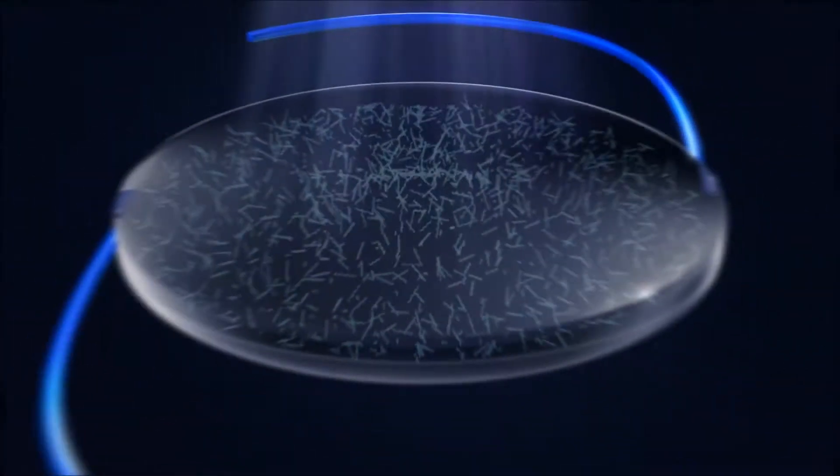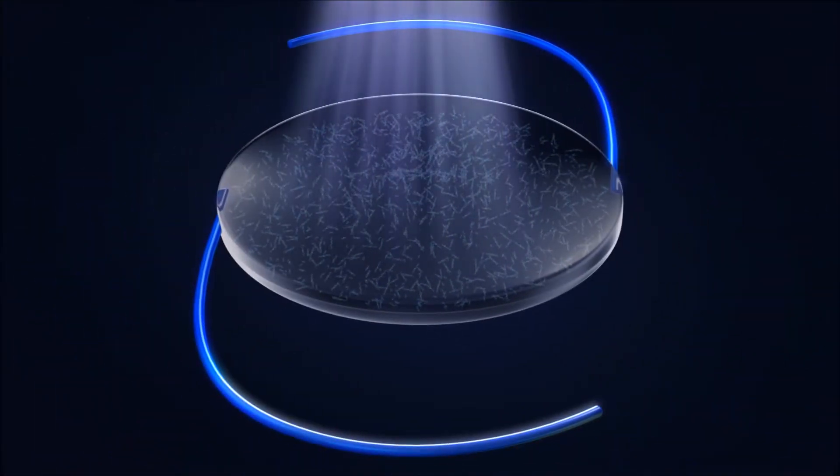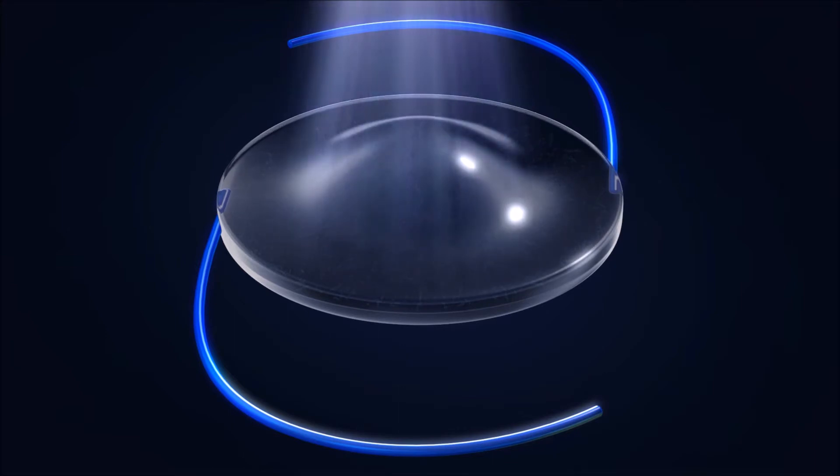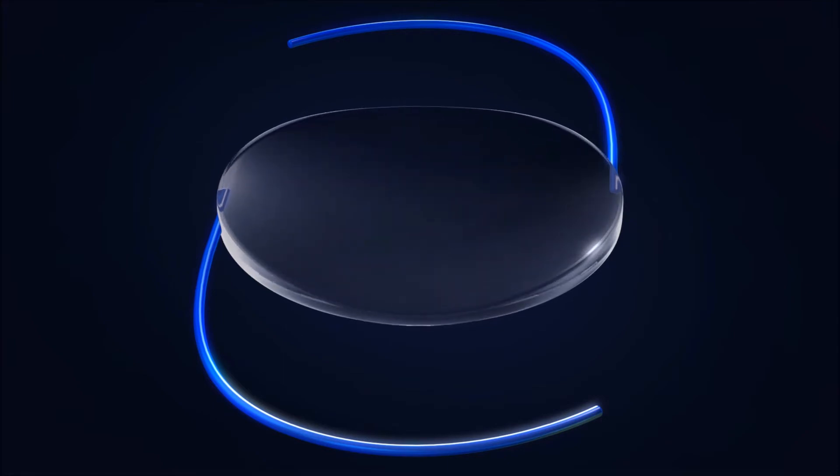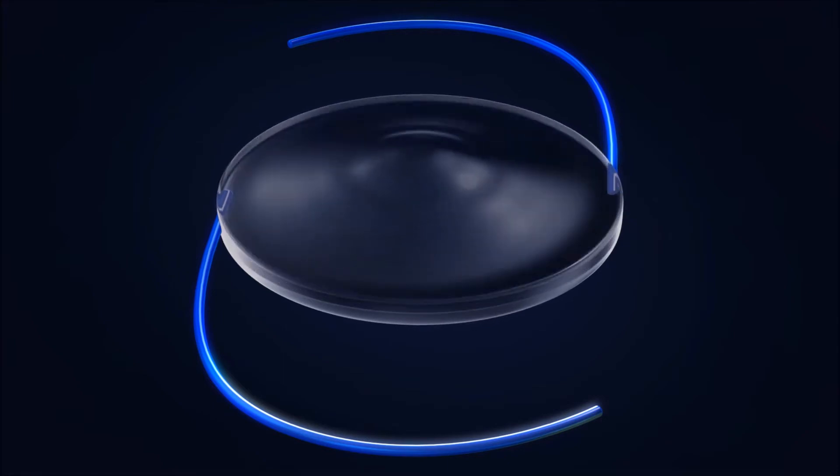The remaining unreacted macromers physically diffuse into the exposed area, causing a highly predictable change in the shape of the lens and a refractive power change of the RxLAL. The light treatment can simultaneously perform spherical and cylindrical adjustments to the lens.